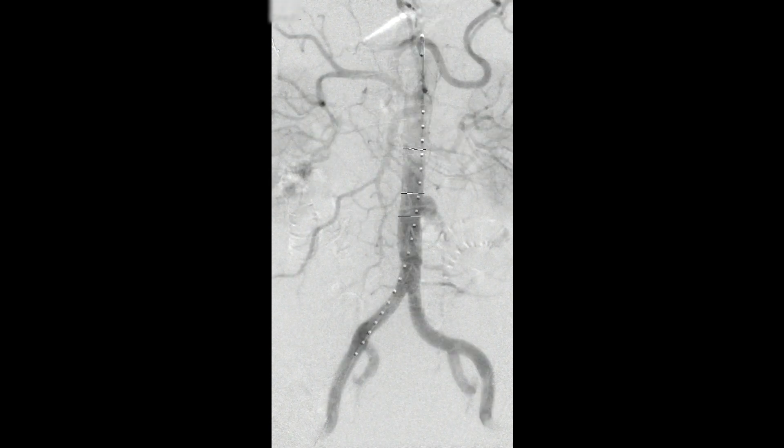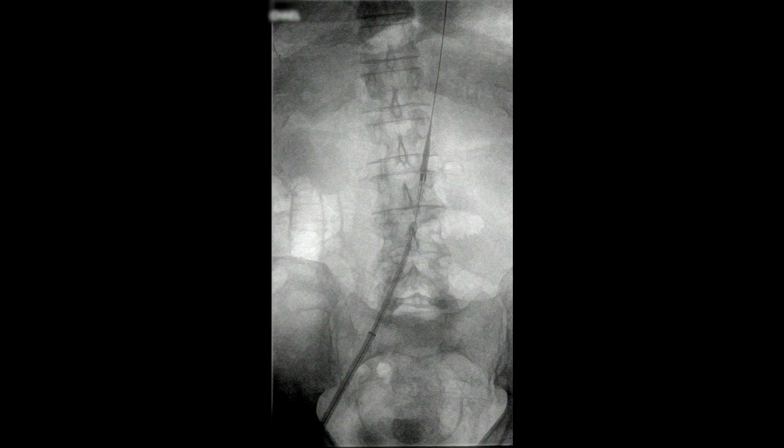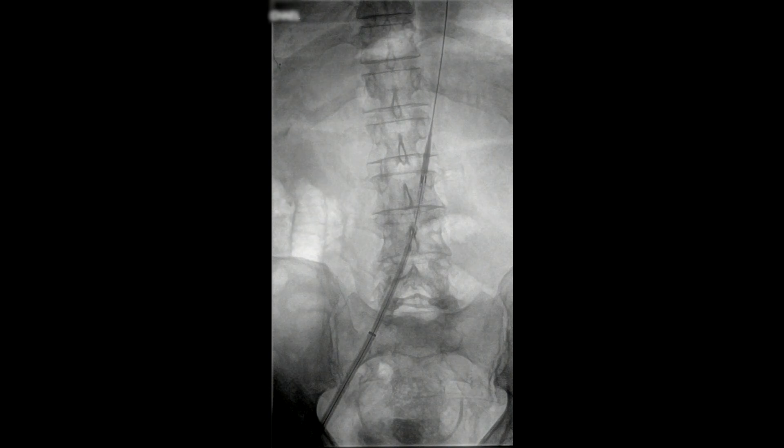Here you see the cuff has been put into position. We have confirmed the actual location of the ulcer. At that point in time, looking back at the previous angiogram, we basically overlaid this and once we had the Gore cuff in position, we deployed the cuff.